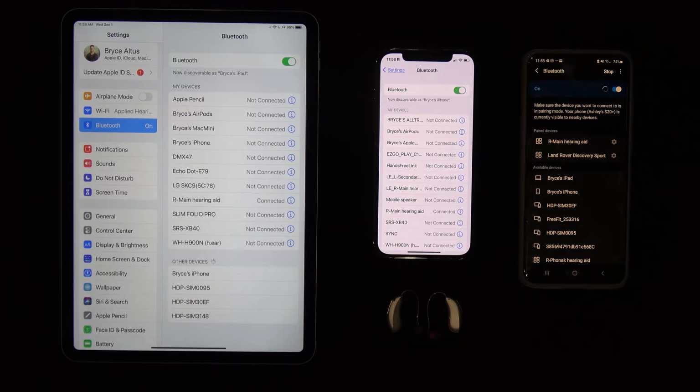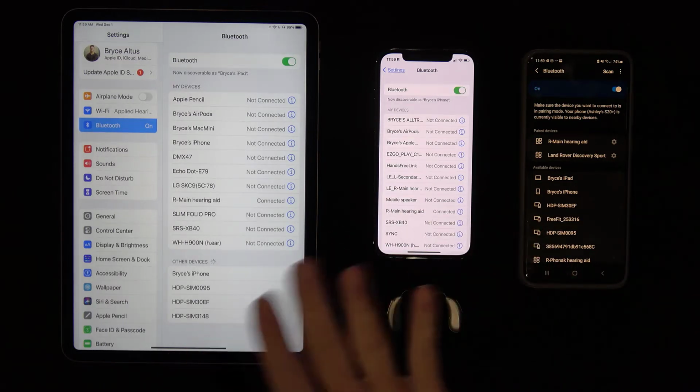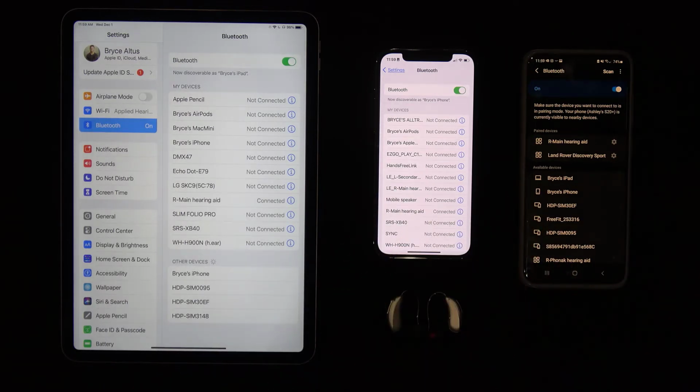For audio streaming, we don't need to worry about the additional Bluetooth connections listed with the LE in front of the device name. These connections are only used for the Phonak app and thus don't need to be established in other audio source devices if we're only looking to send audio from these devices to your hearing aids, and we don't need to worry about using the Phonak app on these devices.